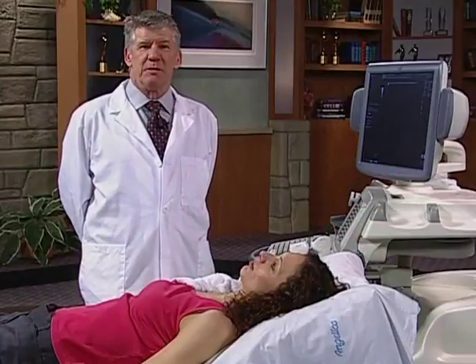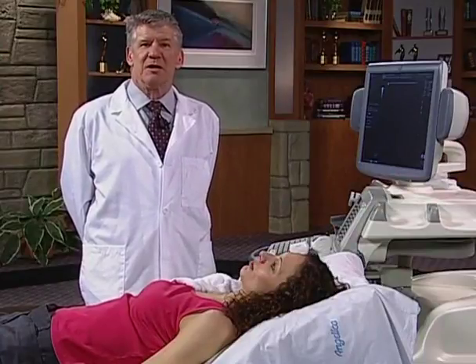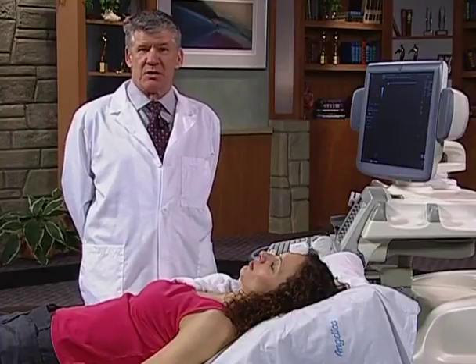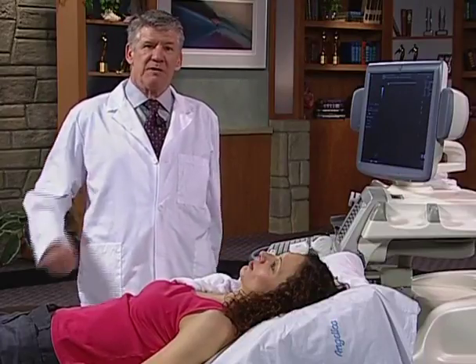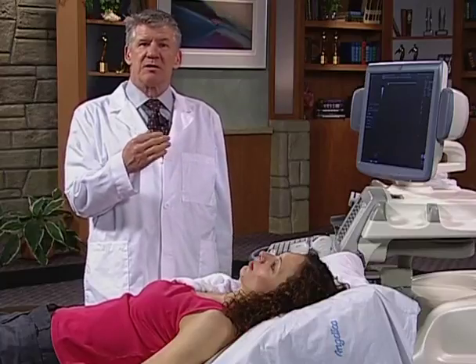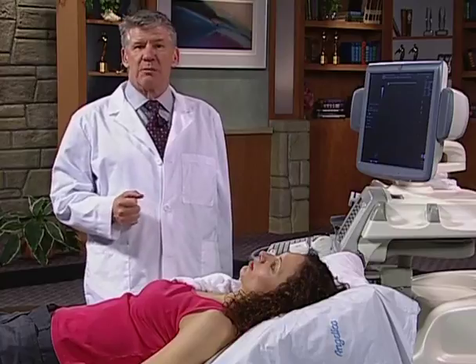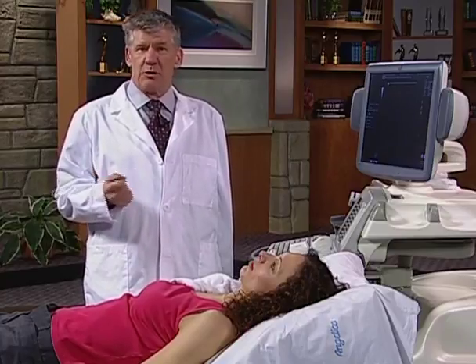I'd like to demonstrate an upper extremity duplex arterial evaluation as we discussed earlier in our lecture portion of the examination. We'll be evaluating the innominate artery, the subclavian, the axillary, brachial arteries, and then down into the forearm for the ulnar and the radial arteries.